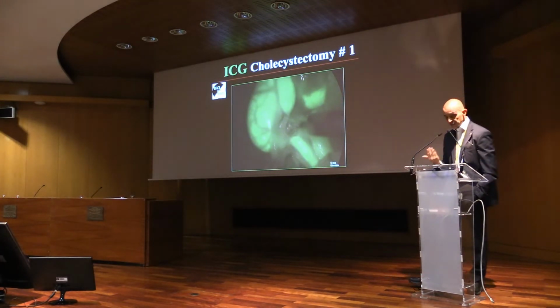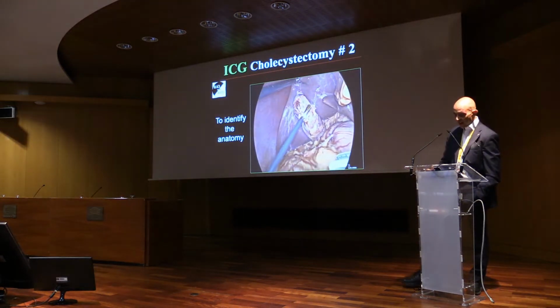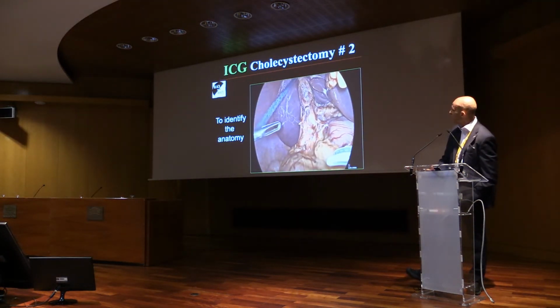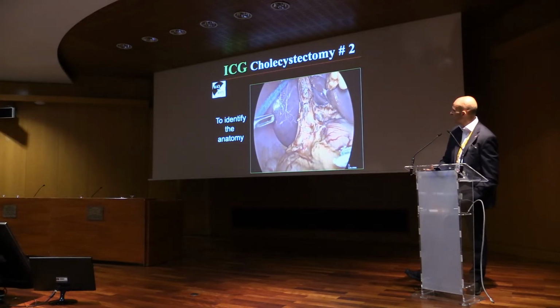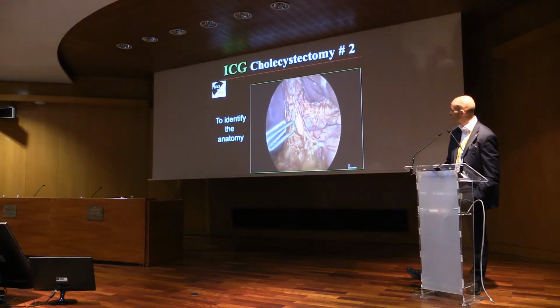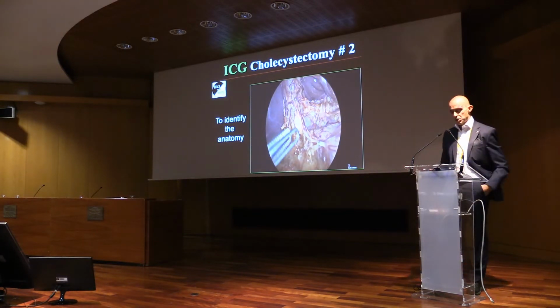Next, I have several videos to show you. As in this case, as you can see, there is a lot of adhesion. It's not clear the anatomy. You can switch to the pedal, you close a little bit the focus, and you can see there is an angulation of the cystic duct. And thanks to ICG, you have a clear anatomy and you have no risk of complication.